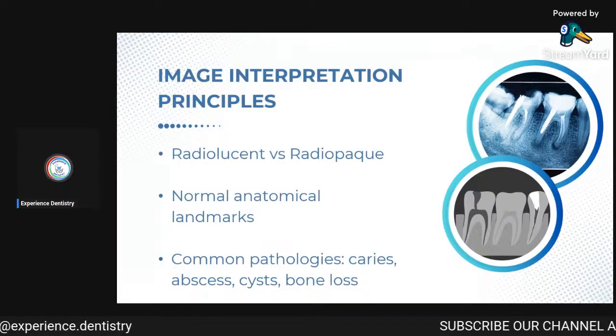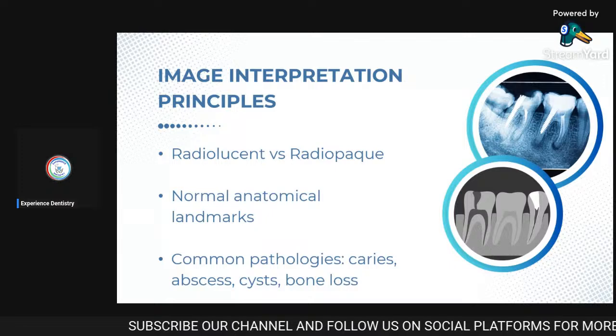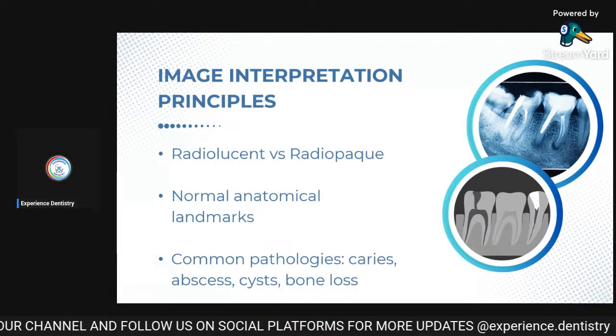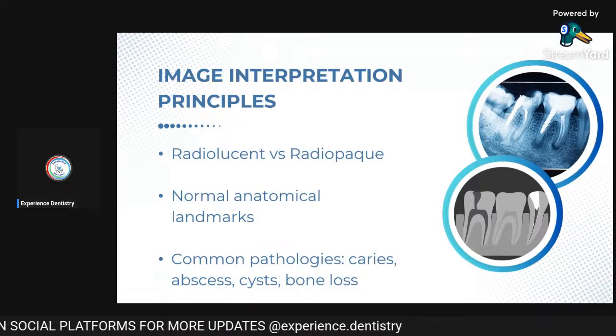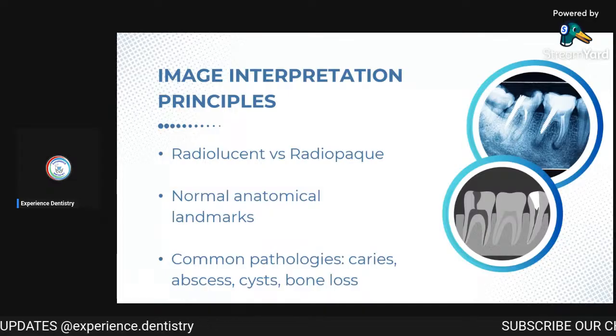Not an implant. There are two canals which are root canals. Okay, these are obturated. Basically, gutta percha has been placed. Gutta percha will be seen as radiopaque. Okay, and then there is a pin. Okay, a pin post placed will also be radiopaque.